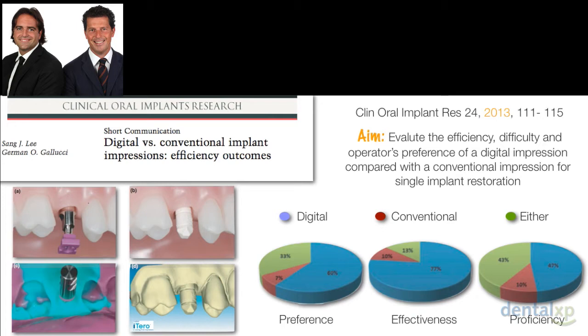The results were that the students preferred to use the digital system, 60%, and that their perception of effectiveness and proficiency was also higher with the digital system than with the conventional impression.